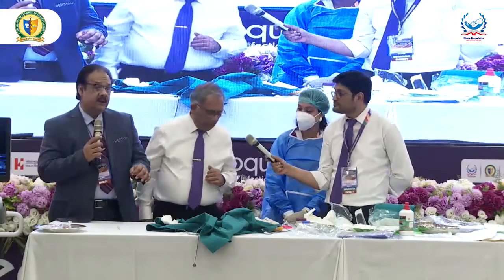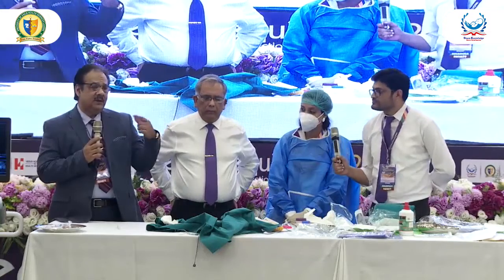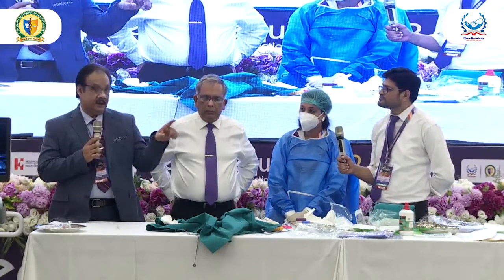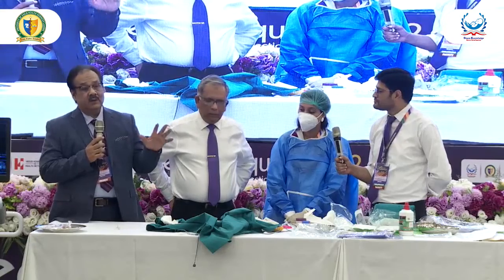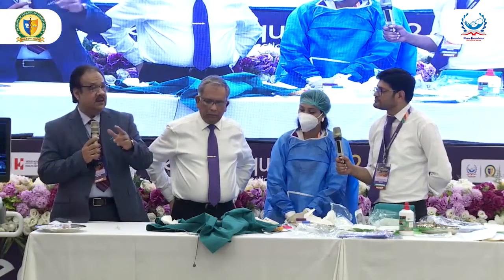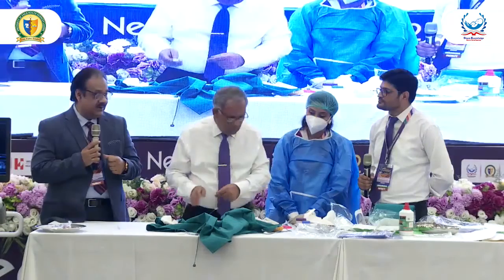The other thing is that when you're removing it very carefully, because if a part of the line remain inside, it happened, the line can be broken. It's a big thing. Then you have to call the pediatric vascular surgeon. He has to do the dissection and has to remove it. There is no other way that you can remove that part. So, and of course, it is a big harbor for the infection.